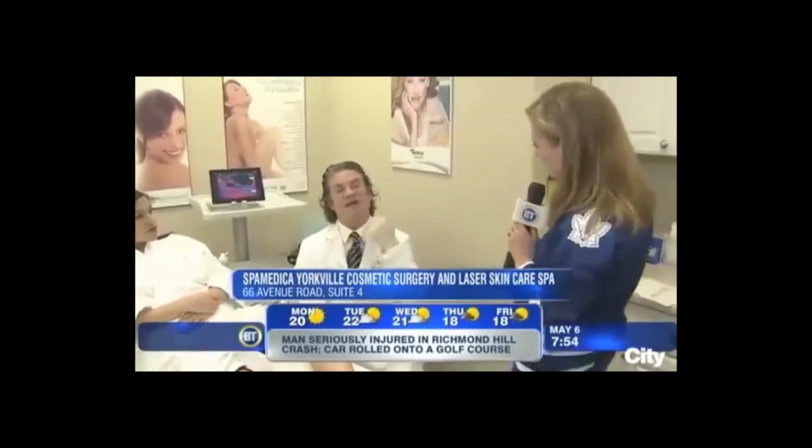Can that be done? Yeah, men get irritation under their neckline when they shave, or they have to shave up close to their eyelids. If you have that kind of hair, most men want that reduced, and laser hair removal, especially these new technologies, is very good for that. You can permanently reduce it, absolutely. And for men, backs and upper chest. Yeah, a man's back. And for women, facial hair and leg hair and bikini hair, very, very common.